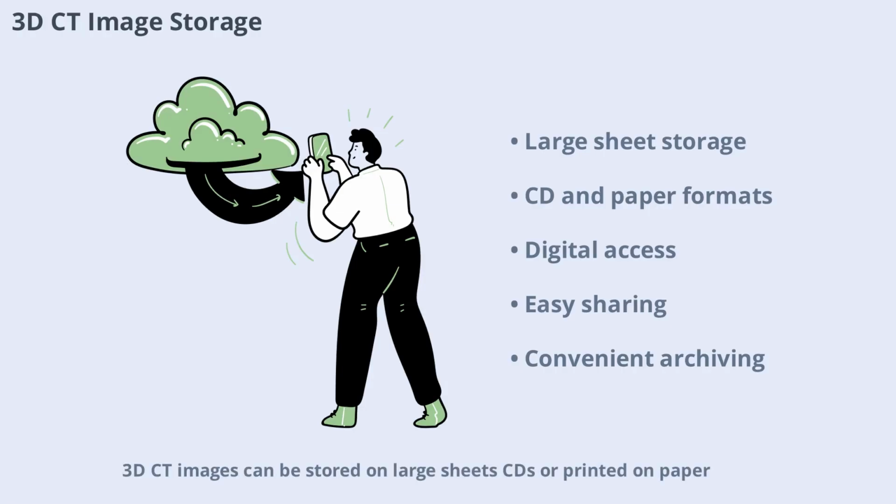3D CT images can be stored on large sheets, CDs, or printed on paper. The storage format depends on the number of images and the intended use. Digital storage allows for easy access, sharing, and archiving, making it convenient for clinicians and institutions.